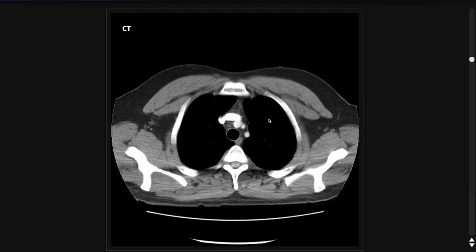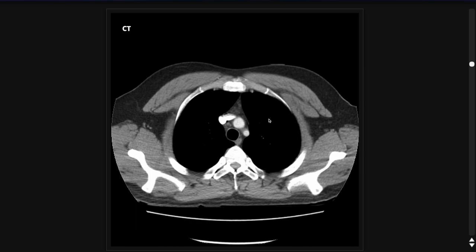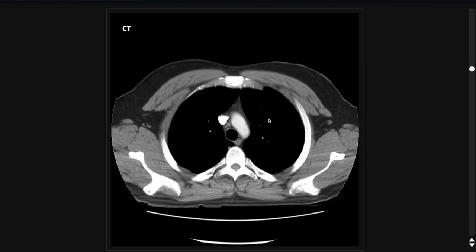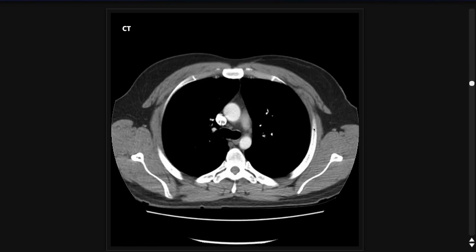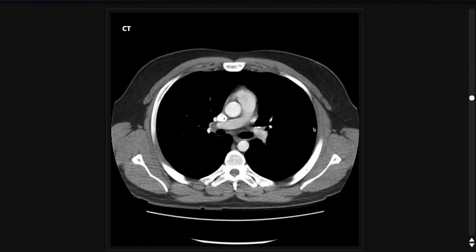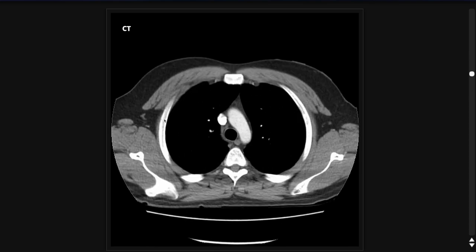I then start looking for lymph nodes. There are a few stations you have to pay attention to on the CT of the chest. The first place I look is the axilla. Here's the left axilla, and you can actually see some nodes — I'm circling one of them with my mouse there. Those are normal. It's normal to see nodes; it's just the ones that are enlarged, typically greater than a centimeter on the short axis.